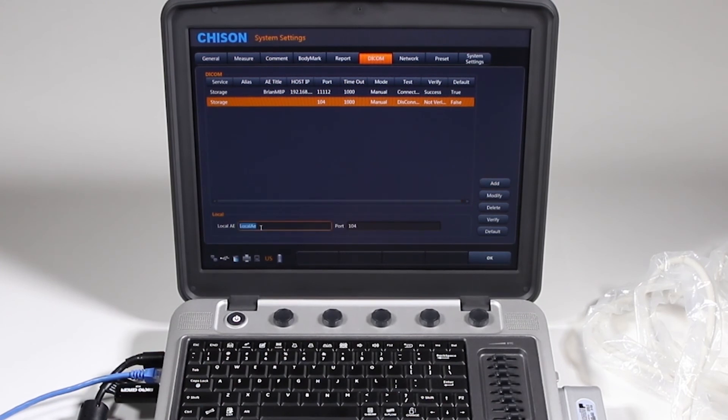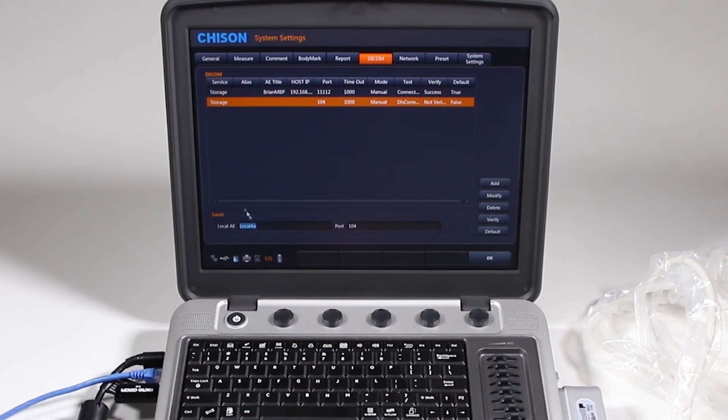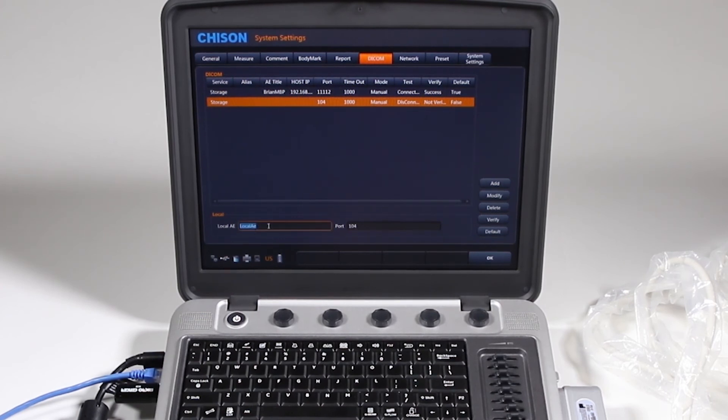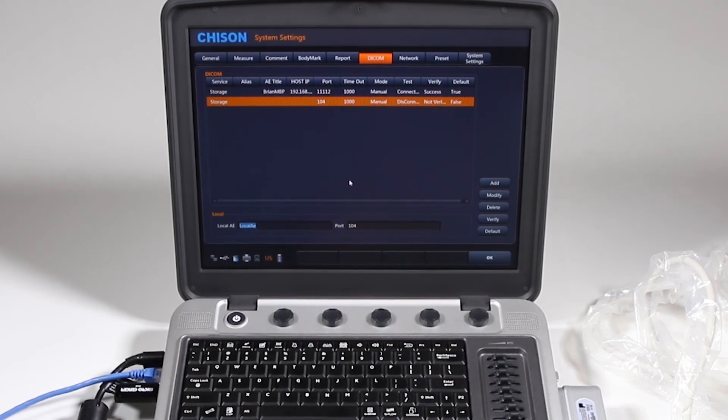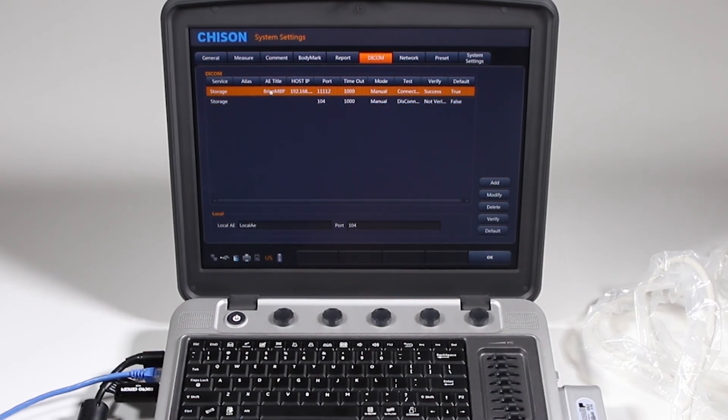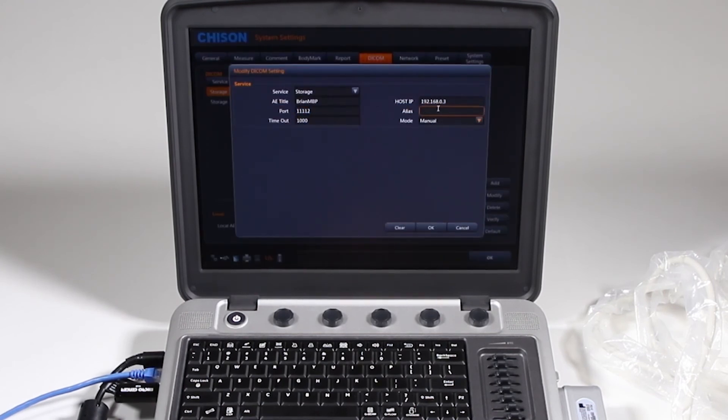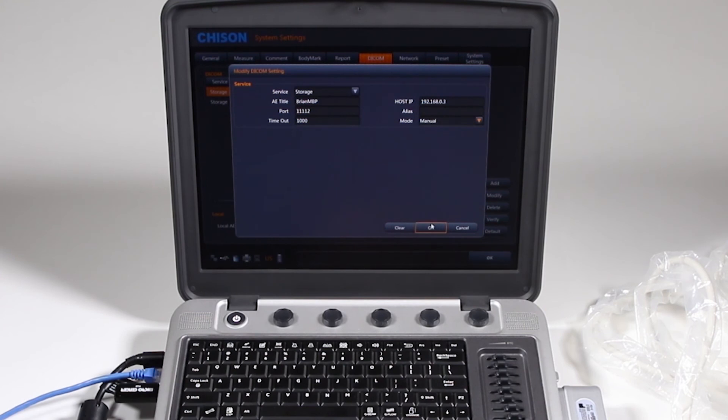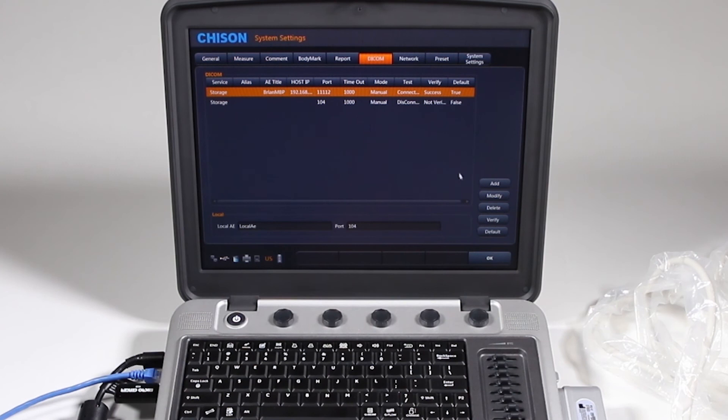By the way, this local AE, your radiology person who gave you all this information here, may say that your machine has to have a name. So you might call it like Sonobook 9 or give it your name and don't worry about the port number unless they give you something. So here, the one that is connected, if I click modify, you can see my settings here and I didn't need an alias for my DICOM server. Go ahead and click OK and I can verify and it says success, true and I'm all set to go.